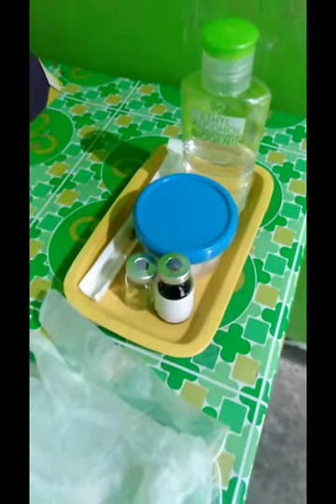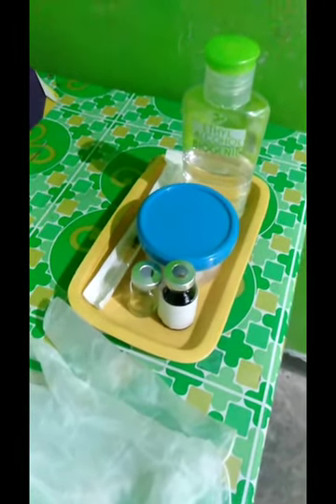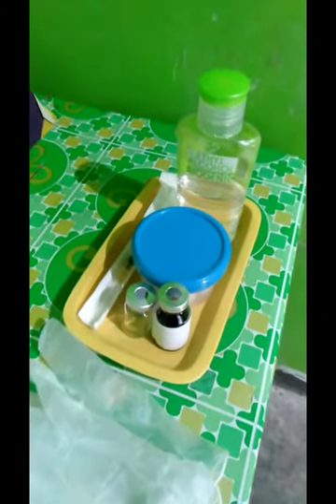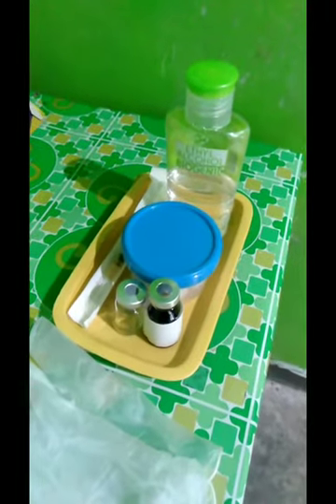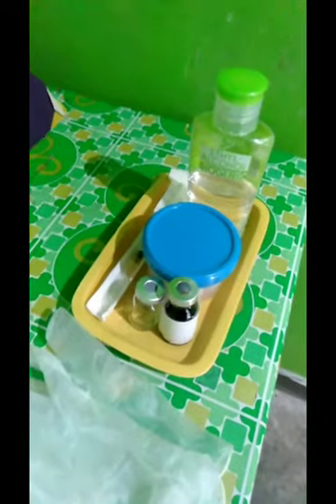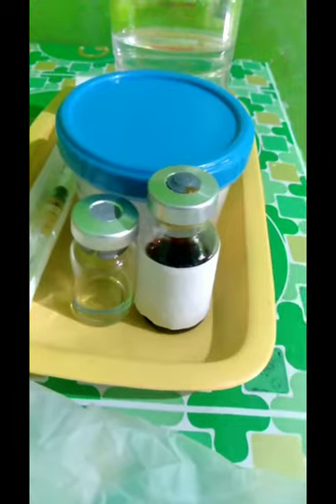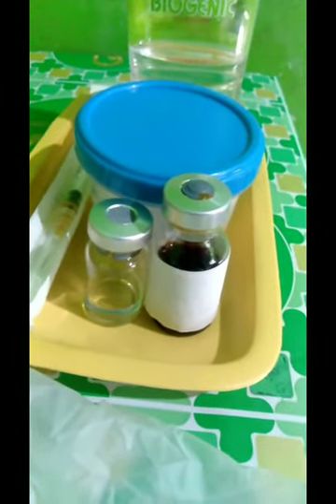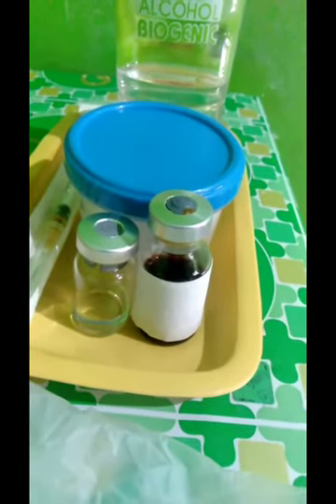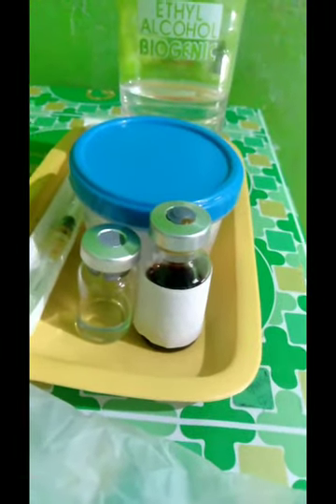The first procedure is to gather all materials needed, check each medication order against the original physician's order according to agency protocol, clarify any inconsistencies, and check the patient's chart for allergies. Know the actions, special nursing considerations, safe dose ranges, purpose of administration and adverse effects of the medication to be administered. Consider the appropriateness of the medication for this patient.